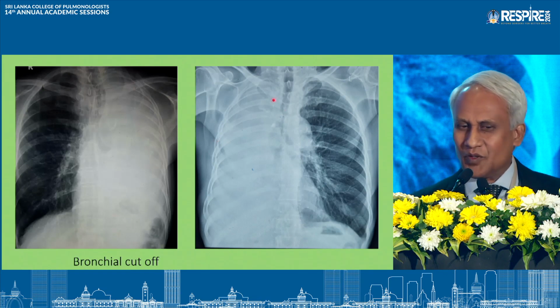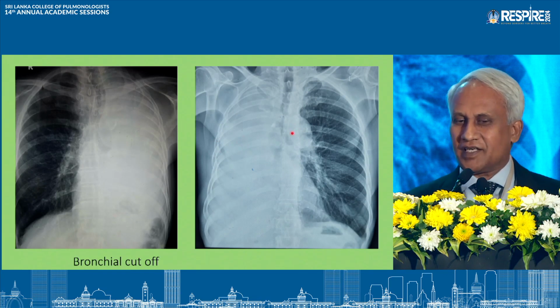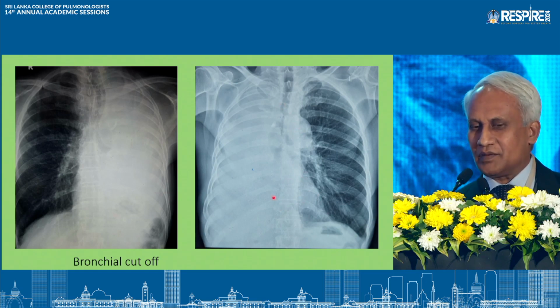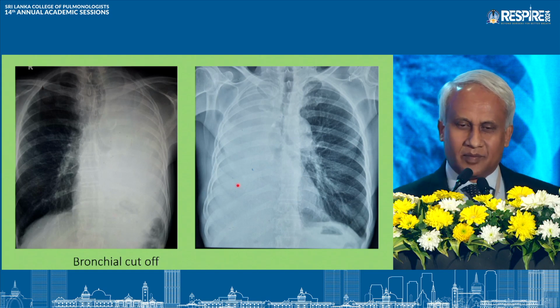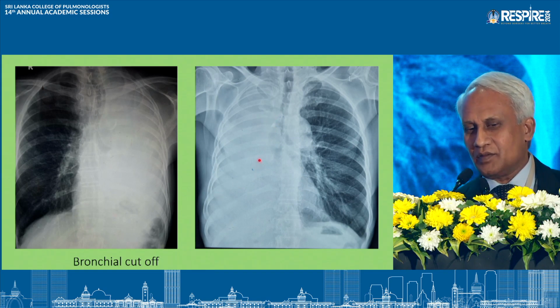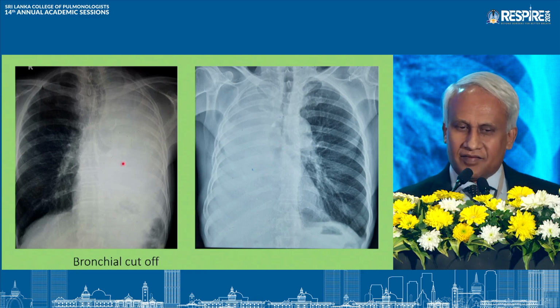These are the X-rays. You can see both the total collapse of lungs. So you can see the tracheal deviation, you can see the moving of the heart to the other side. I don't know whether there is some fluid inside, but always look at the entrance to the main bronchus and see whether there are some opacities here. So this is the left lung collapse.